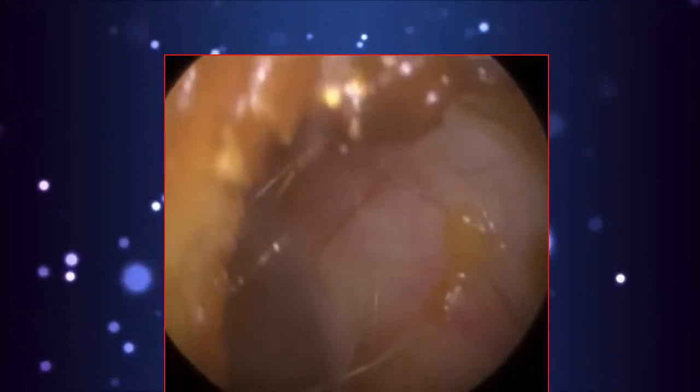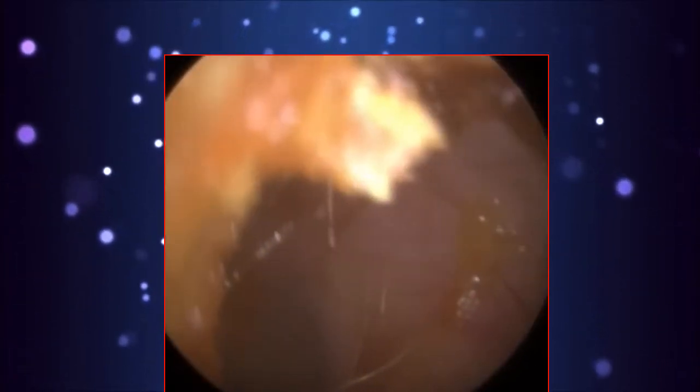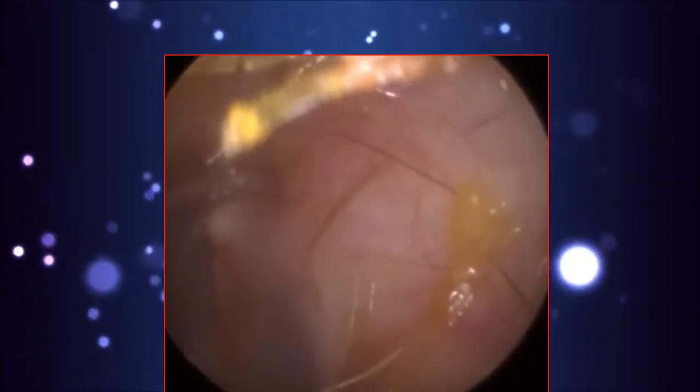So although it was sticky and glutinous, it still did hold its shape somewhat, and it wasn't blocking the suction probe on a regular basis. So I just continued. You can see the patient's got a bit of matted hair there. So this plug came out in, I think it came out in 2 pieces, or was it in 1? Let's have a look. No, so I've got the main bolt there. On the periphery, some sticky wax. Now the patient's hearing's restored. Removing this per se is not going to improve their hearing, but it's on the lateral part, so I'm just gently using the suction probe to release the sticky wax off the canal wall.